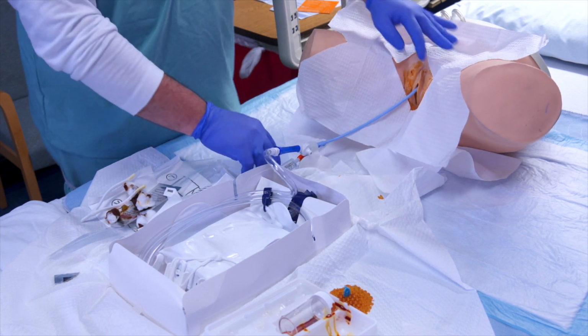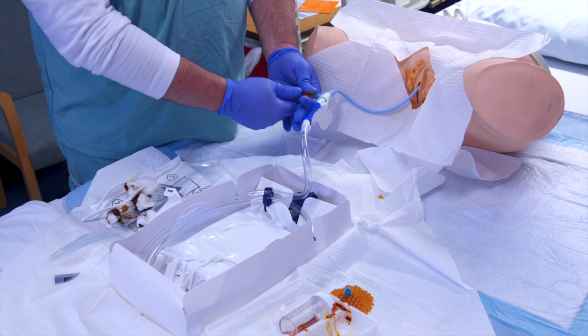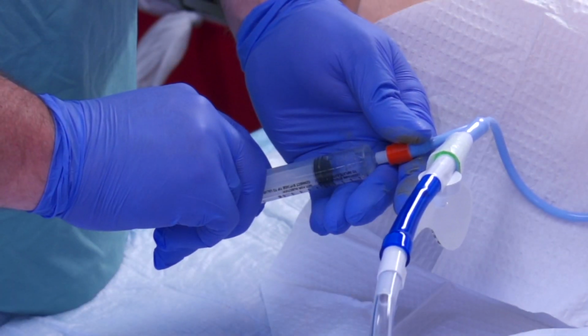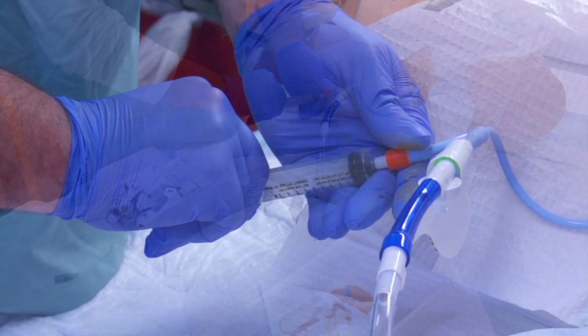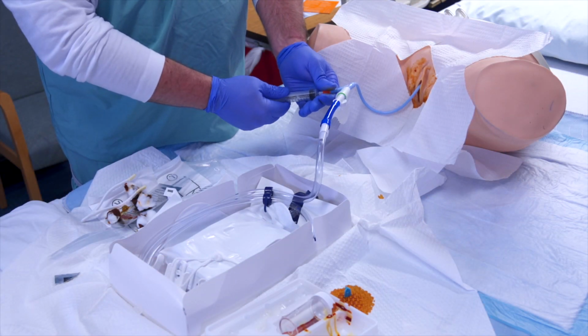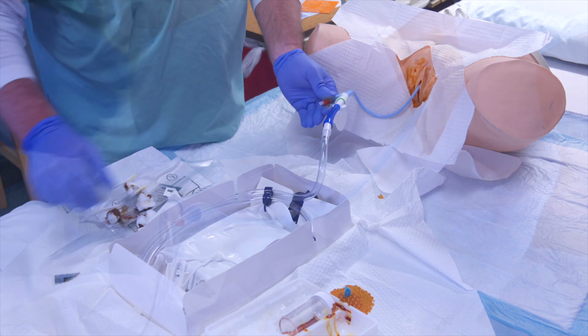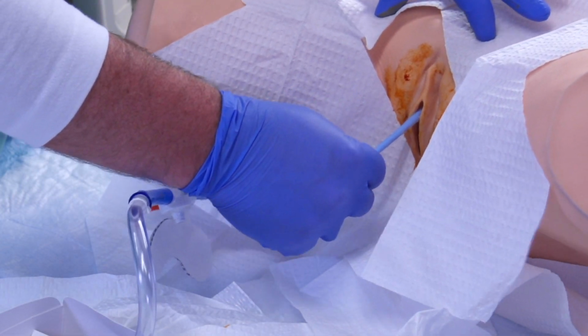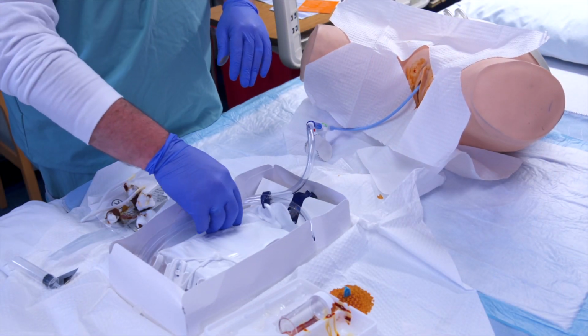Hold the catheter firmly in place while you inflate the balloon with the entire 10 milliliters of sterile water provided in the tray. Disconnect the syringe from the inflation port. Gently pull back on the catheter to ensure that it is in place against the bladder neck. Release your hand from the perineal area.